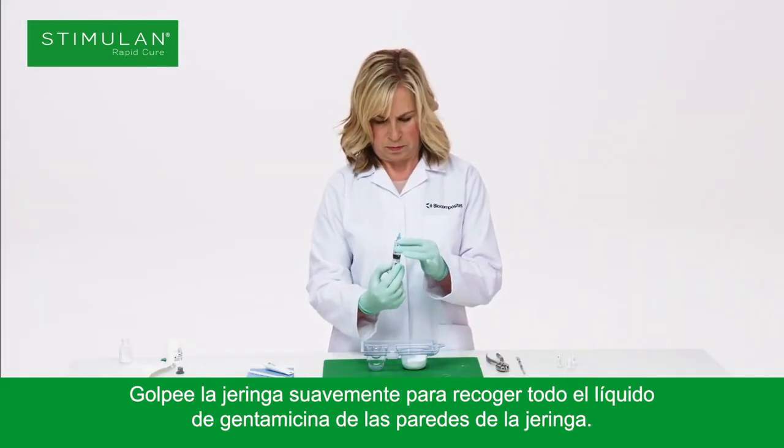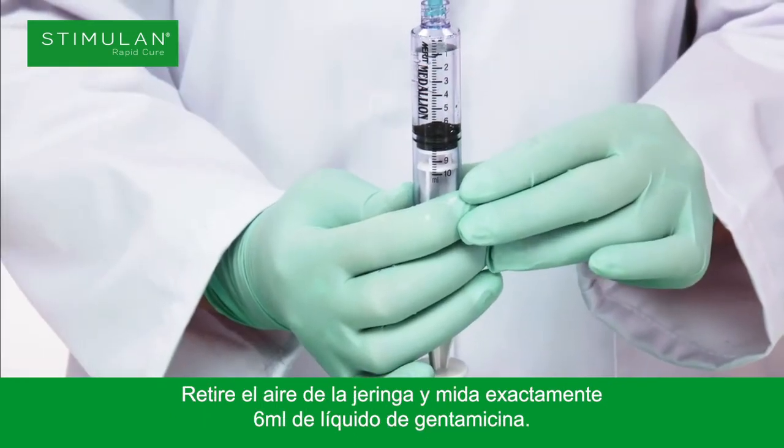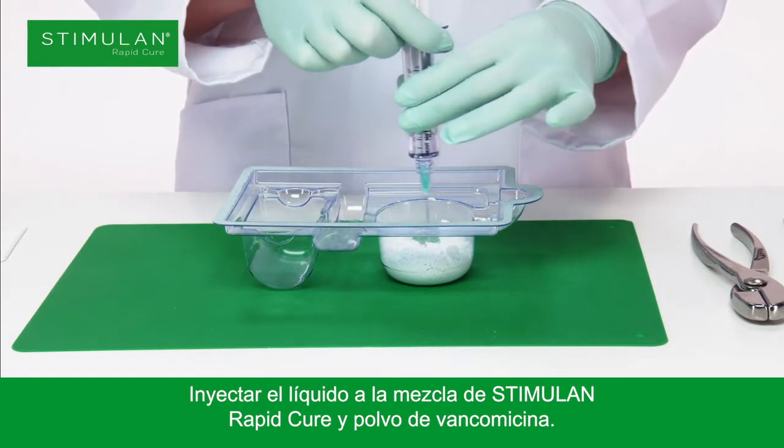Gently tap the syringe to collect all the gentamicin liquid from the walls of the syringe. Remove the air from the syringe and measure exactly 6 millilitres of gentamicin liquid. Inject into the pre-mixed Stimulan Rapid Cure and vancomycin powders.